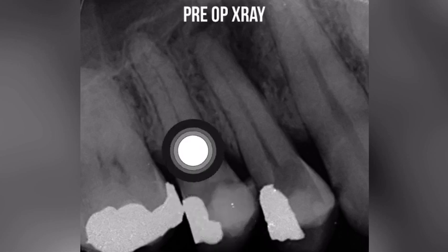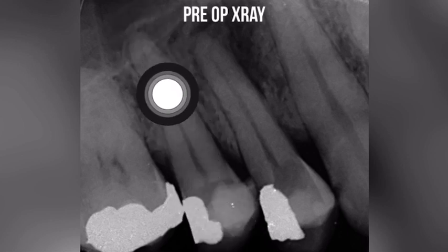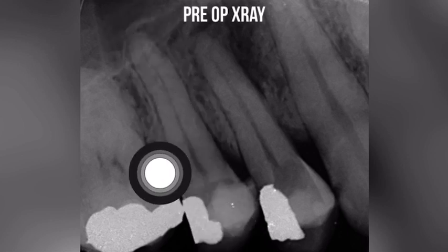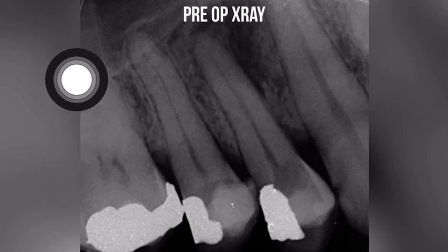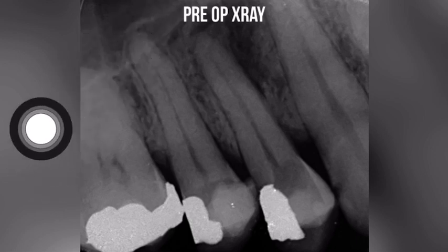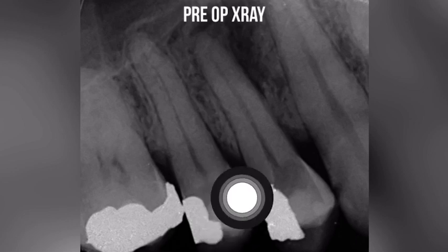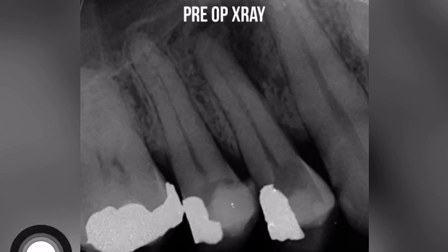Pretty straightforward case: a little bit of curvature, a few curvatures at the apical part, a little bit of periapical radiolucency — nothing too much — a big decay, temporary filling, and a distal amalgam filling.